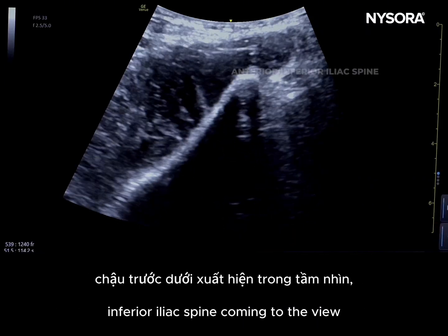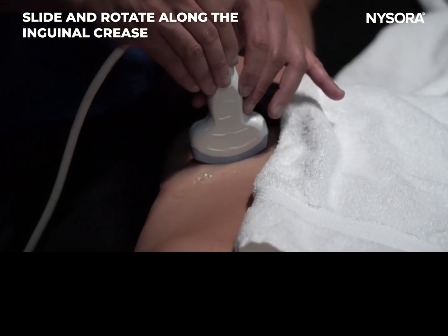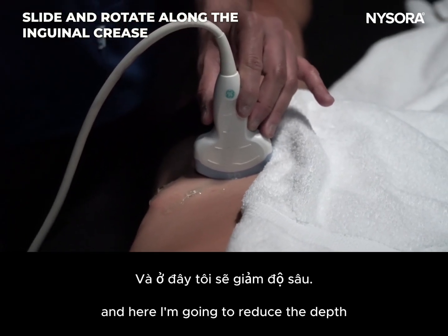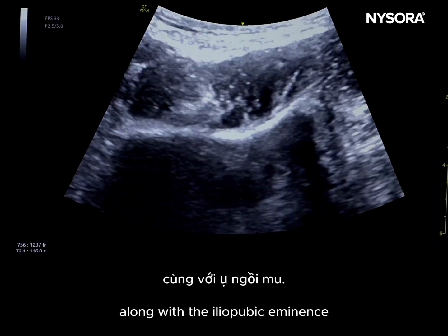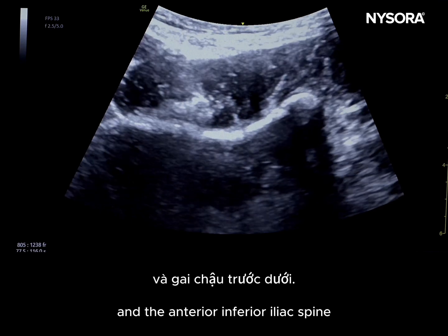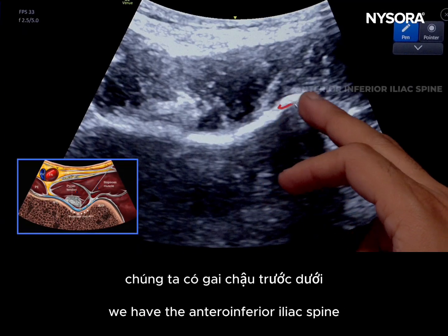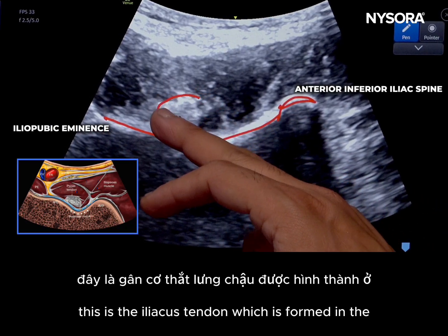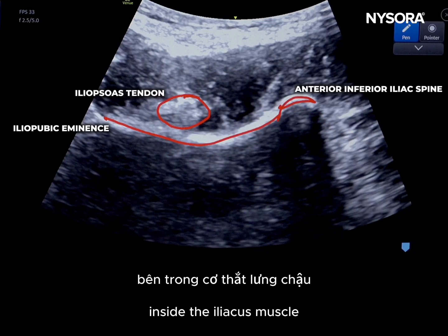Once you have the anterior inferior iliac spine coming into view, as I mentioned, we will be moving the ultrasound probe along the inguinal crease. And here I'm going to reduce the depth, showing you the image of the iliopsoas tendon along with the iliopubic eminence and the anterior inferior iliac spine. So on the ultrasound image here, we have the anterior inferior iliac spine. This is the iliopubic eminence. This is the iliopsoas tendon, which is formed inside the iliopsoas muscle.